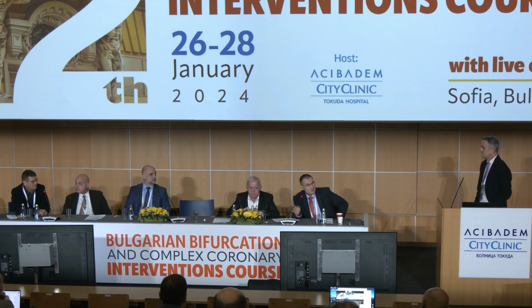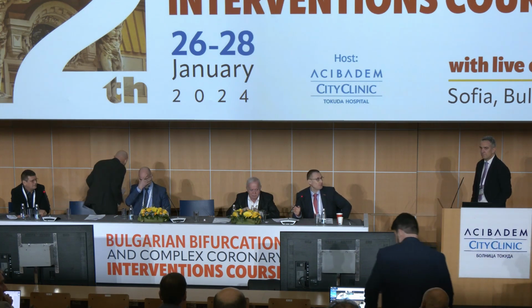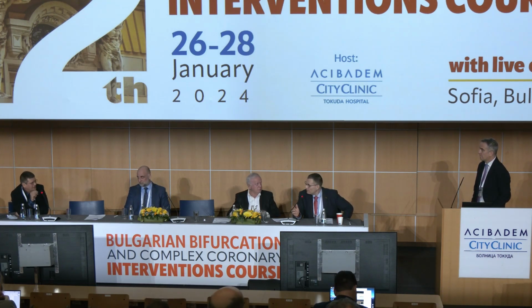We personally work with 7.5 frames per second as a working frequency, because at 3.75 on our machines the quality is not good for fluoroscopy. Especially for more massive patients, it is really difficult.